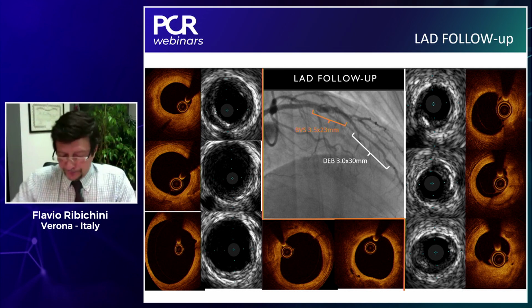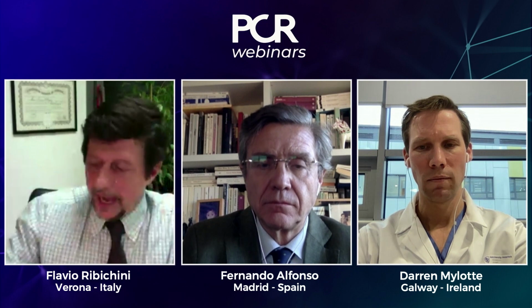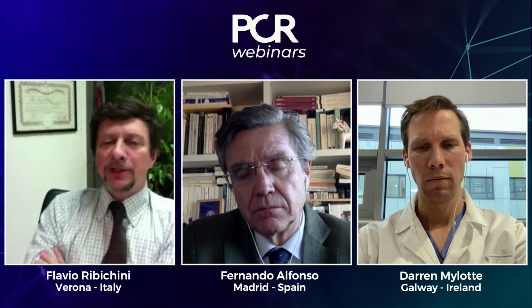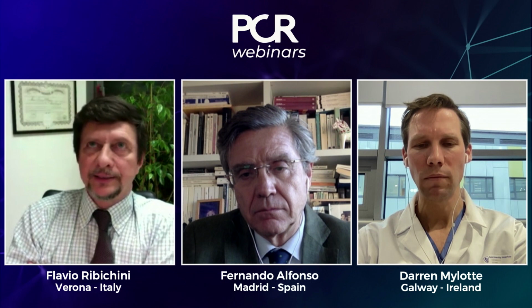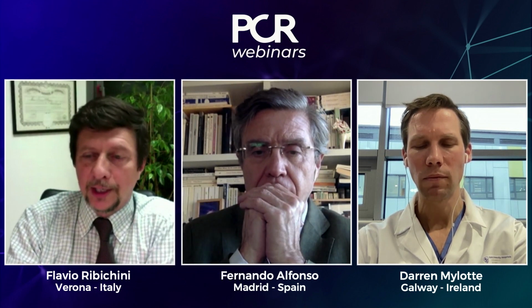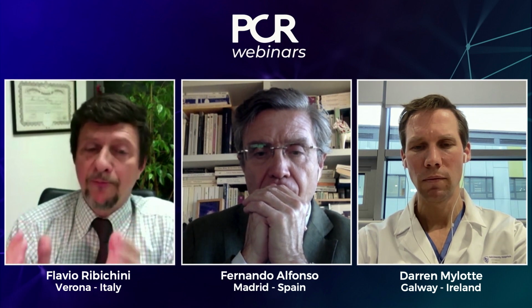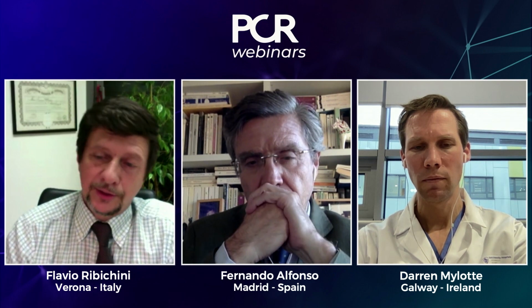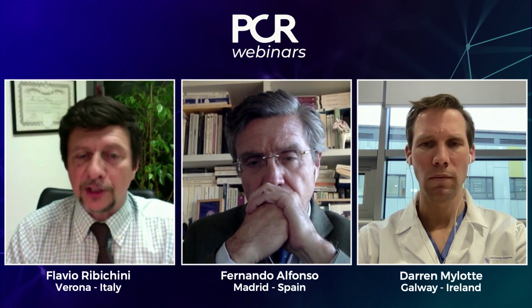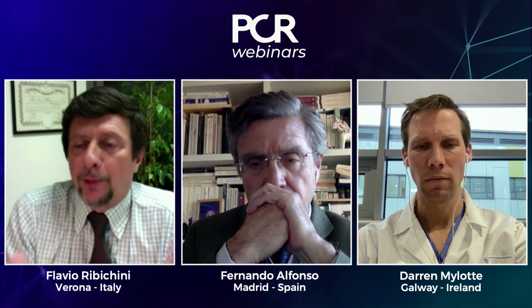So this is to show you one out of many cases. We don't have many cases of long-term follow-up, and I think this is one of the main limitations of the data we need to convince ourselves and to convince our colleagues to trust the efficacy, because we have been focused on the safety and trying to show you that there is no more infarction, no more thrombosis, but still we have to accept this suboptimal angiographic result compared to stents.